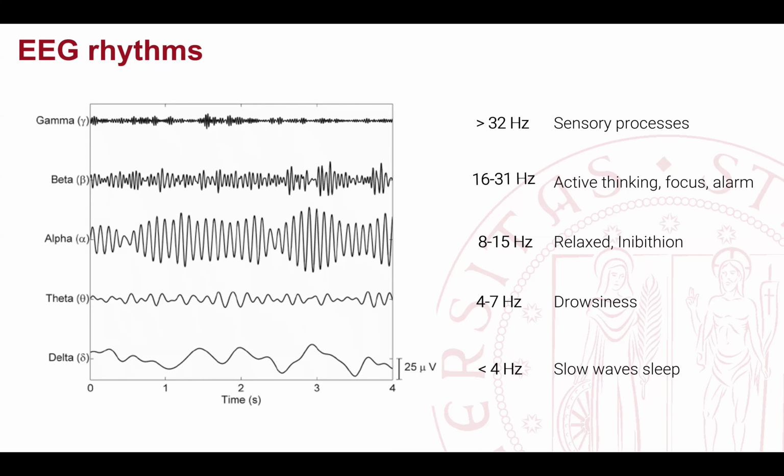And these alpha waves are very interesting because they can easily be modulated through attention processes. If you are able to record the EEG activity on yourself, one of the first things that you do to check that you are really recording a proper EEG signal, and not just noise, is to see the signal while the subject has their eyes open, and then to ask the subject to close their eyes. And you immediately see an increase, and the EEG signal will look exactly like this. So all these components will basically disappear, and you will see for certain periods exactly these waves.